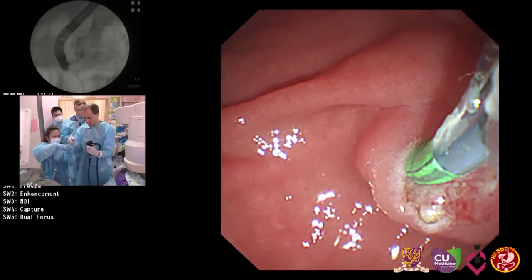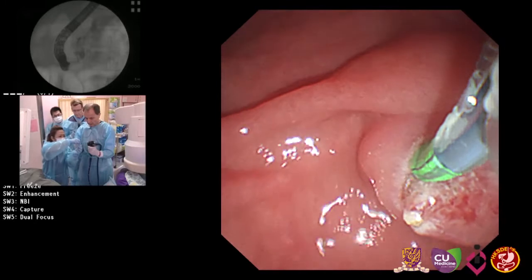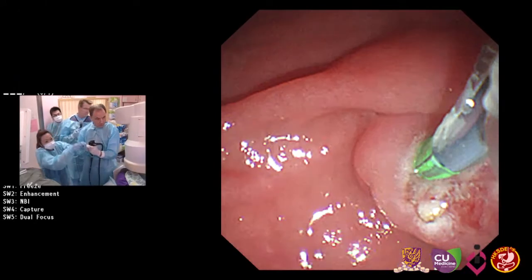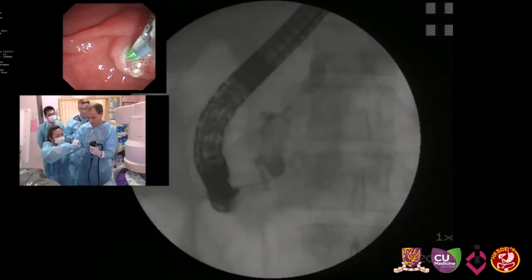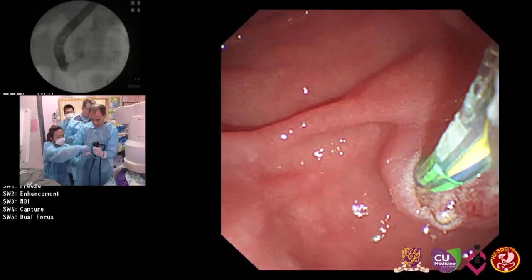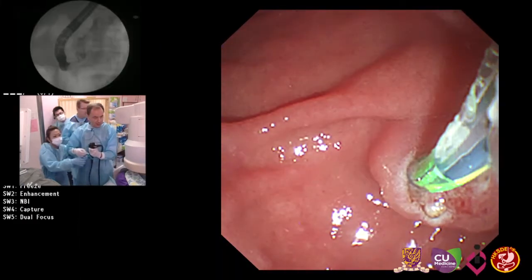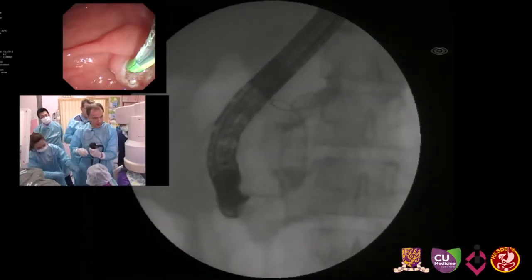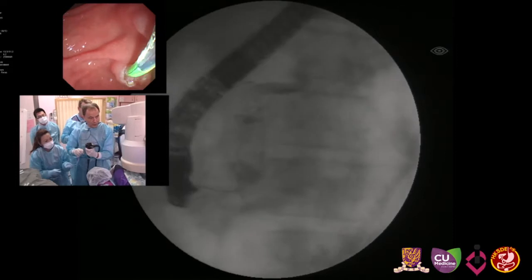Split the wire from the sphincterotome. Oh, you lost the wire? Split it. Okay, but the sphincterotome is deeply inside. Now I can manipulate the wire by myself. There we go. Nice. Loop formation is beautiful. Always good.